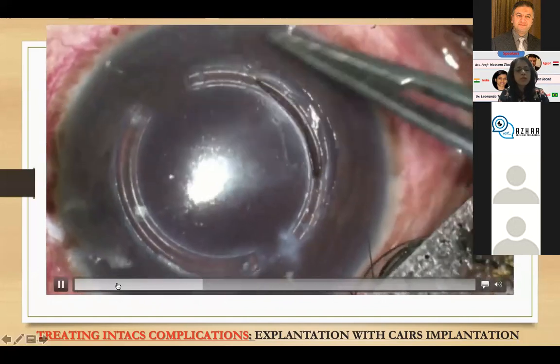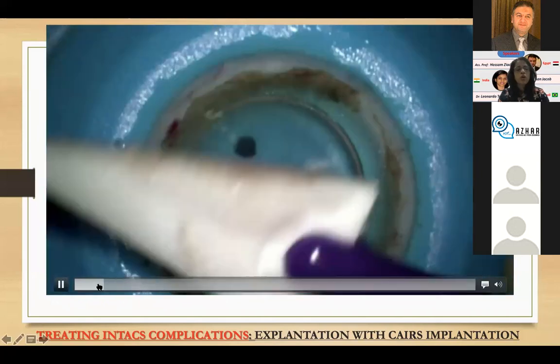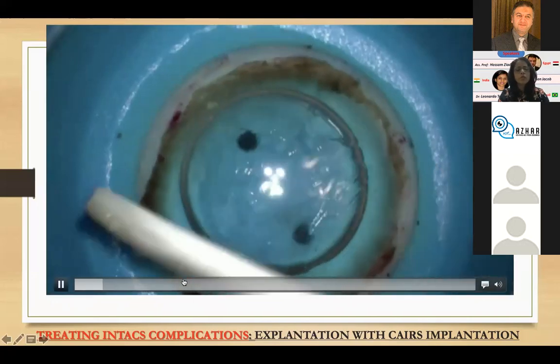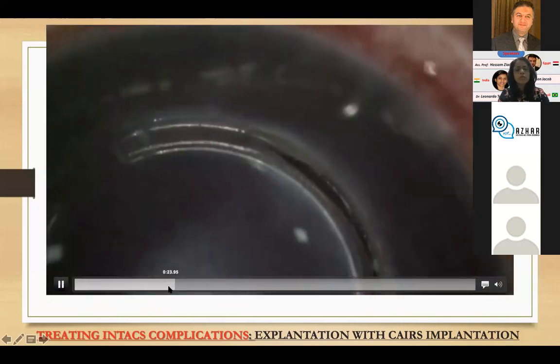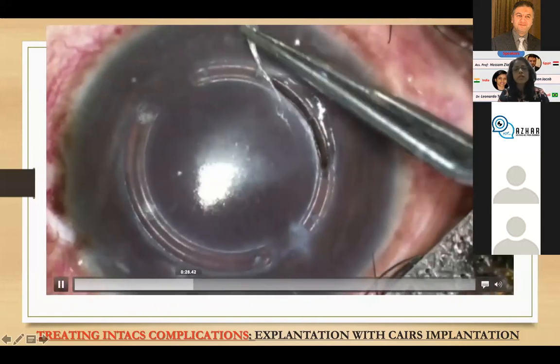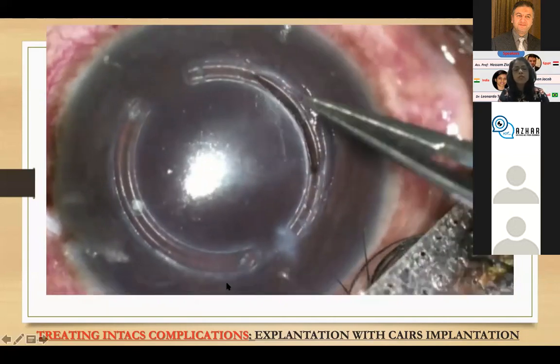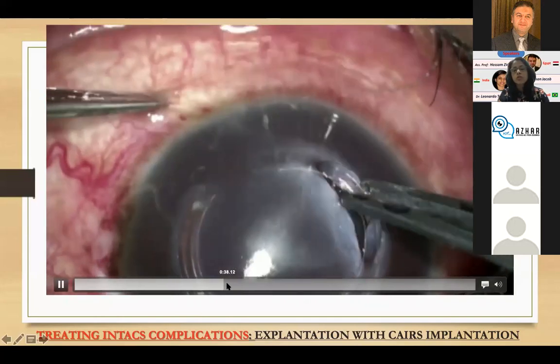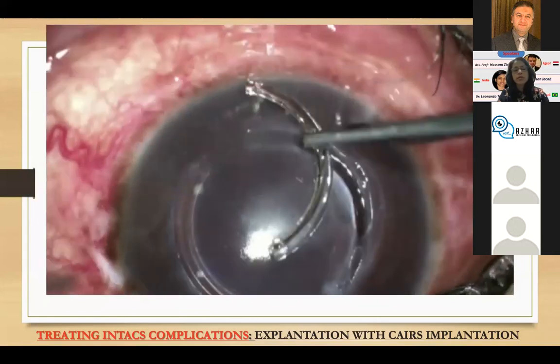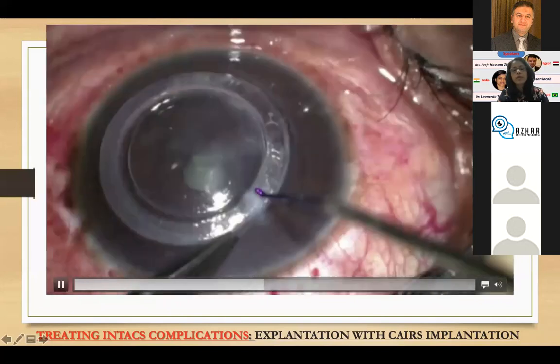I have one picture which I'd like to show you, that was the anterior segment OCT of that patient. And you can see that it's almost completely exposed segment. So coming back to this part of the video where I'm removing the epithelium, you can see that the area of melt is actually larger. So it's quite big now. And obviously this would lead on to complications if you don't remove it. So this was a patient who definitely needed explantation. And anyway, you cannot leave exposed segments there because they're always a risk factor for developing infectious keratitis and serious loss of vision.